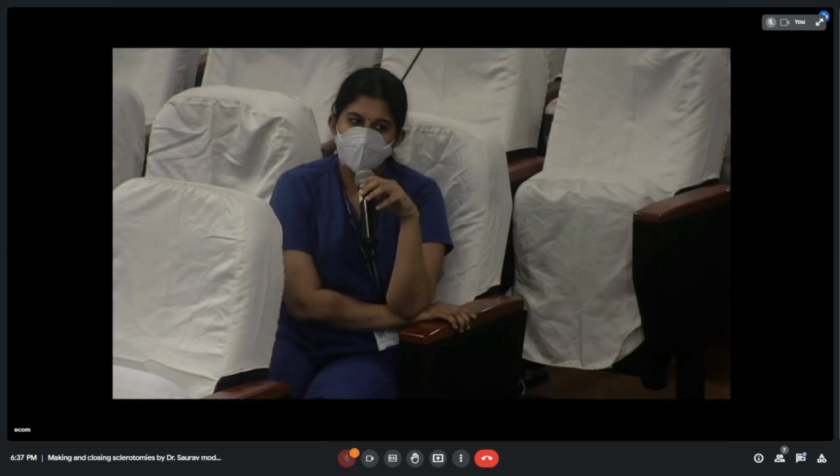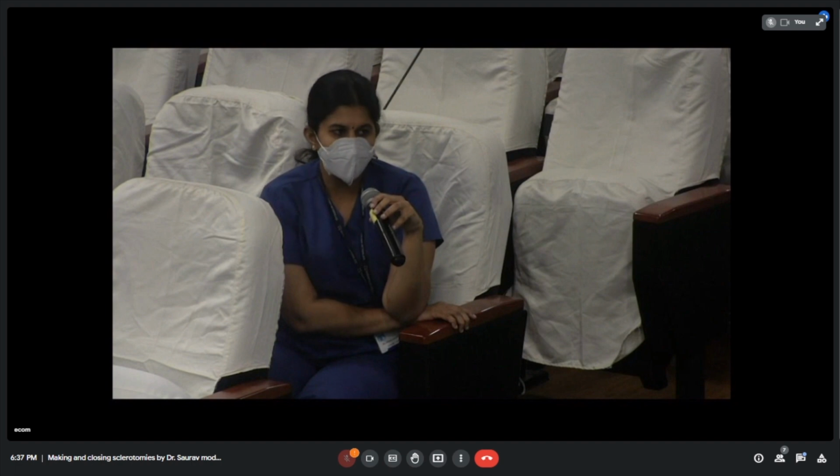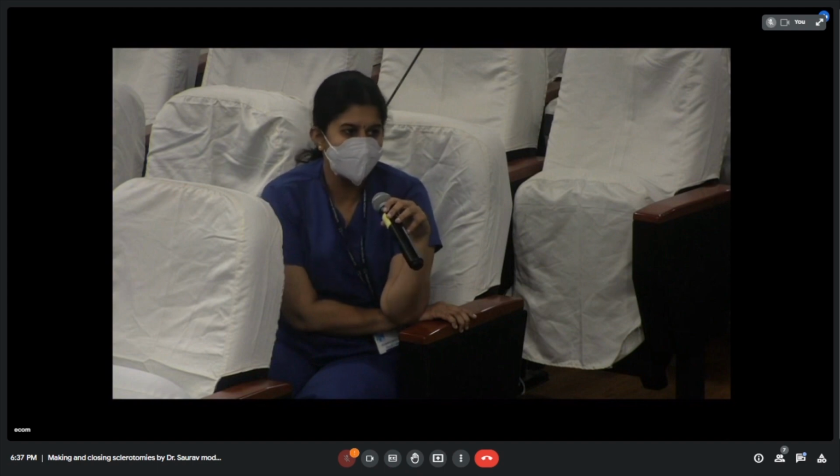Thank you, ma'am. The most important take-home message before performing the sclerotomy: see the tip under the microscope. Sister will say it is new, but it may not be. Please see the tip under the microscope.